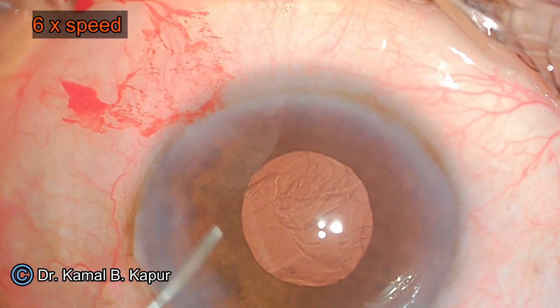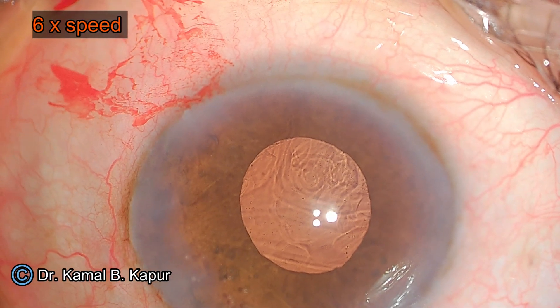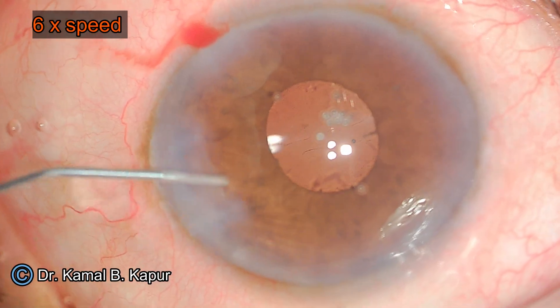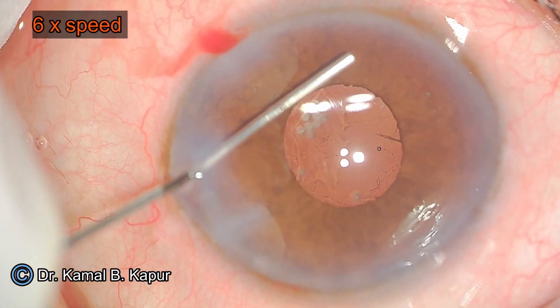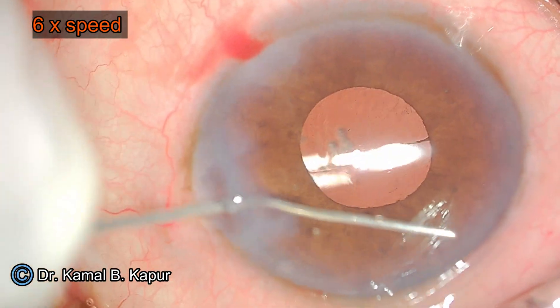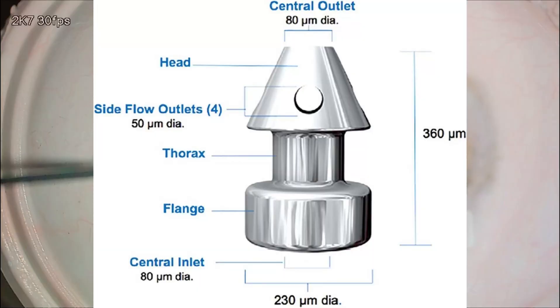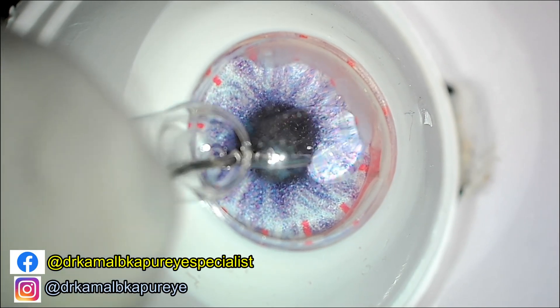We have instilled viscoelastic in this eye along with a slight amount of pilocarpine. Pilocarpine or any kind of miotic is used to make sure that the angles are wide open and also provides good visibility of the trabecular meshwork. These are the dimensions of the microscopic, amazing-technology eye stent.